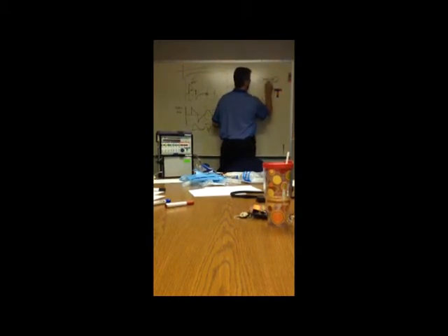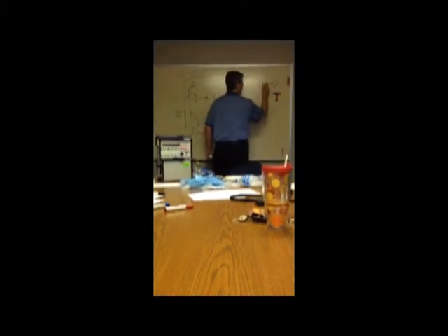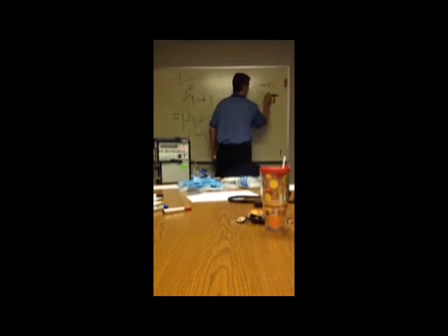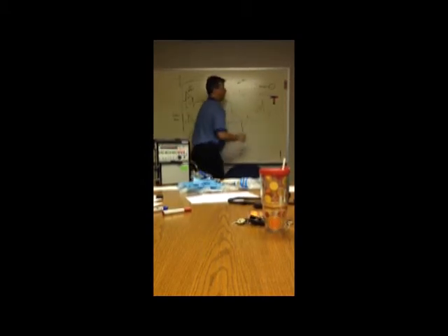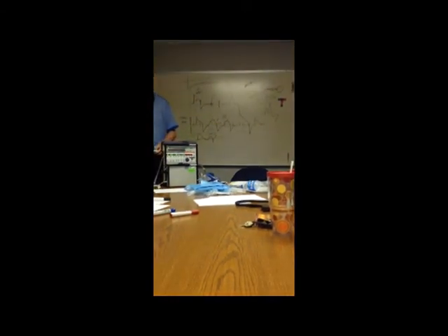This is the ET2 right here, okay? This is the ventilator, this is their lungs. I'm blowing so fast this way that the amount of air can't get through this tube to their lungs as fast as I'm blowing. So the pressure in the ventilator, where it measures the pressure, goes up, and as the air finally gets through the tube, it'll come down. But at this point, you've got pressure built up here, the ET tube.